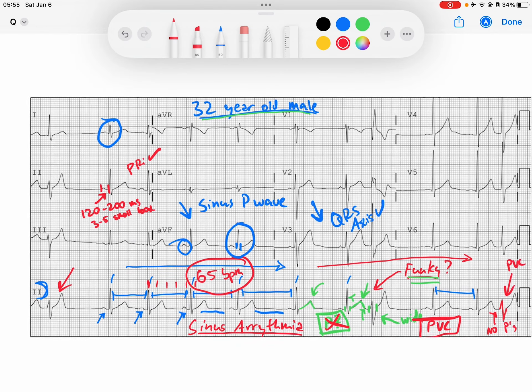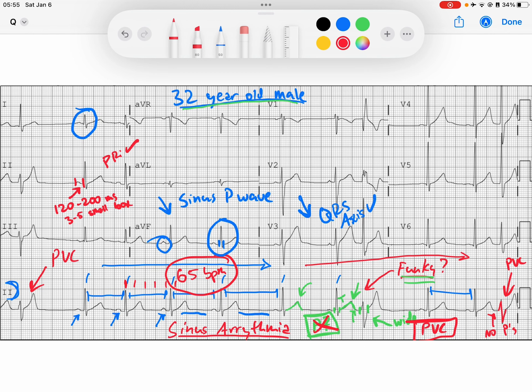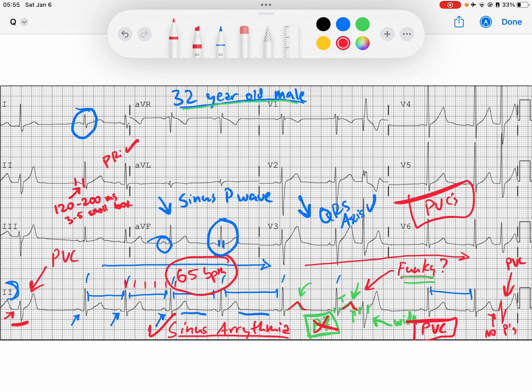And we've likely got another PVC here — a wider complex QRS with no P waves in front of it. Remember, if you're worried about a P wave but a T wave is obscuring your view, compare the T waves to the previous T waves. If you see maybe a double notching in that T wave, there's probably a P wave hiding in there. But that's not what's going on in this case. So our overall diagnosis of this rhythm is sinus rhythm with sinus arrhythmia and PVCs. I hope this helps you — have a great day.